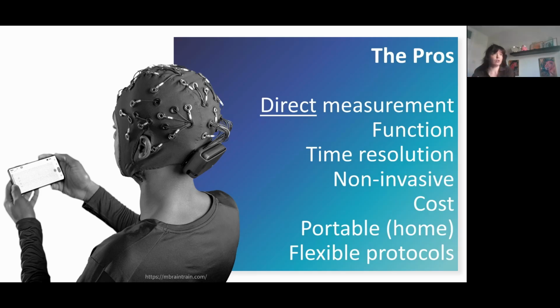First of all, you're measuring brain function. As I mentioned before, that can be attractive, especially when you're looking at short-term or immediate acute drug effects, as well as longer term drug effects. You could expect that once your drug is in the cerebrospinal fluid at sufficient concentration, neuronal function could be changed in a matter of minutes. And then that can be a prolonged effect going on hours or days. So you could expect to see changes in a very short time frame, which can be nice, for example, if you're doing a pharmacokinetic study.